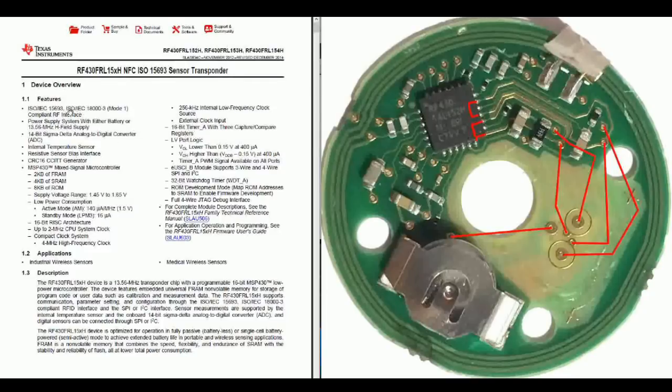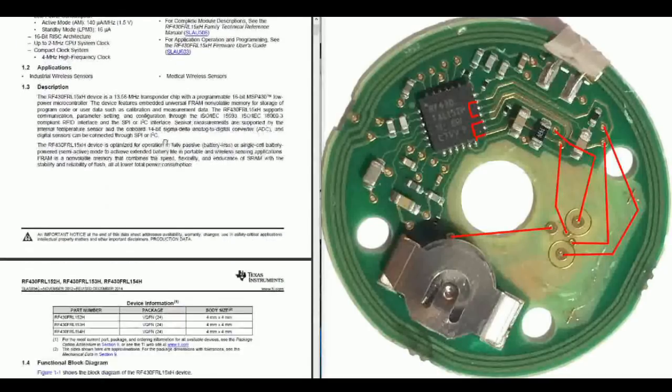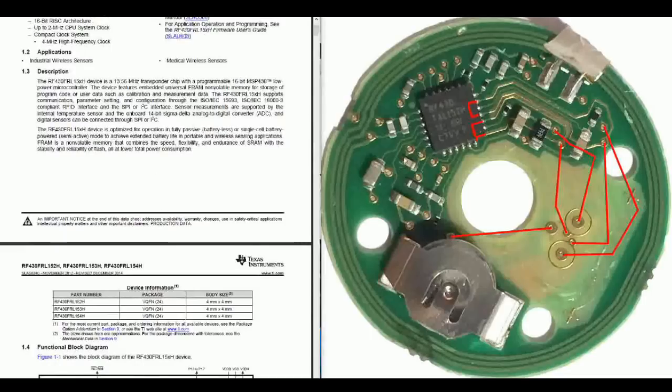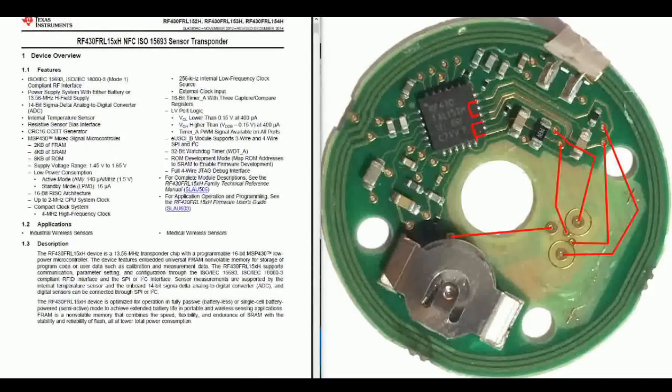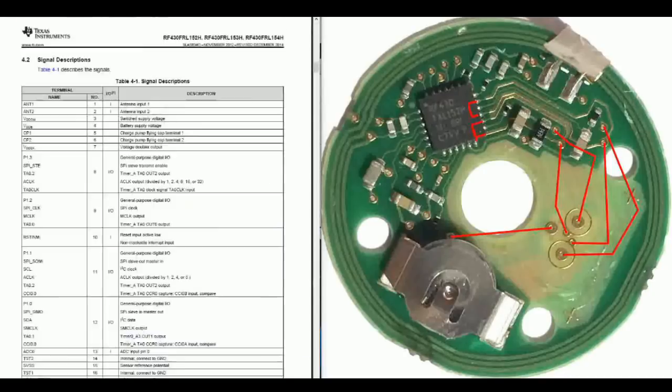And this is what the main features of the chip are, and you can see here, its applications are industrial wireless sensors or medical wireless sensors. And medical being what's in use here. The package information shows it's a VQFN, a 4x4mm chip, so it's quite small. And now let's have a look at the pinout.